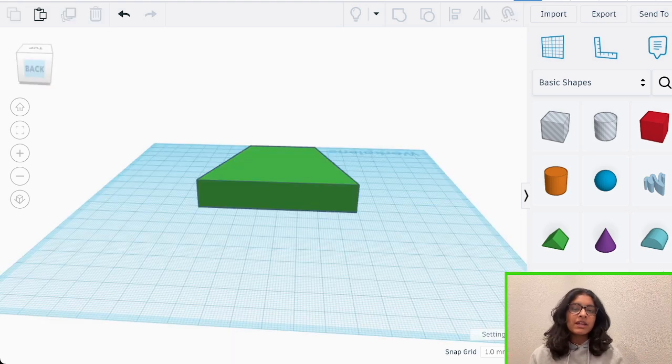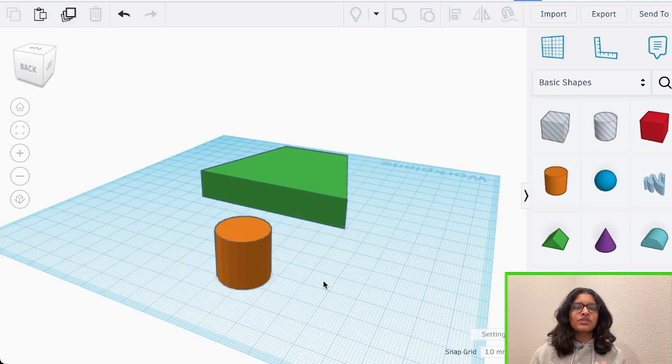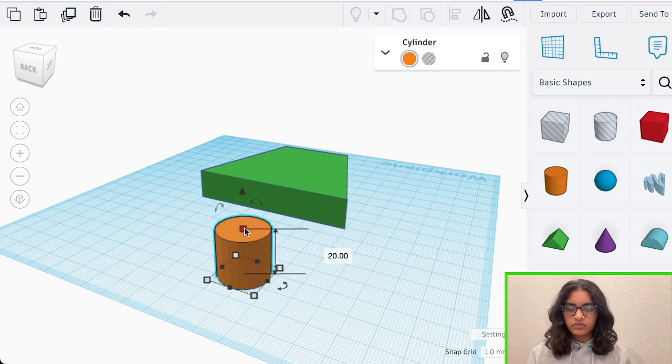Alright, so next we're going to be making arguably the hardest part of our hand design, which is the finger. We're going to start off by just dragging a cylinder over to the work plane. Change the cylinder's dimensions to be how you want the first joint of your finger to be. Meaning, if you're looking at your finger, what would you want this half of the finger to look like in terms of breadth, depth, and size? Now we're going to be using very specific dimensions for our base project, but if your fingers or the fingers you want to design are a bit thinner or thicker, feel free to change them.